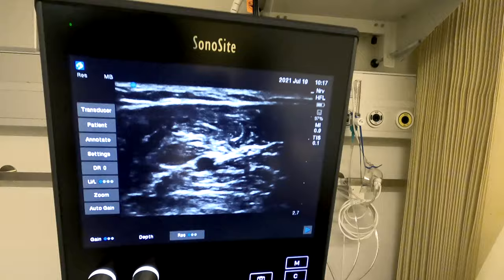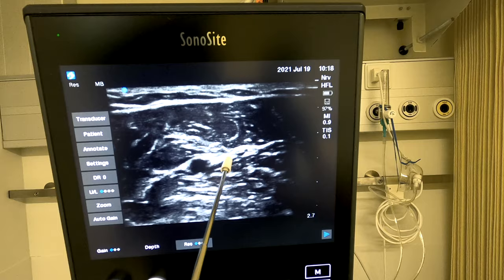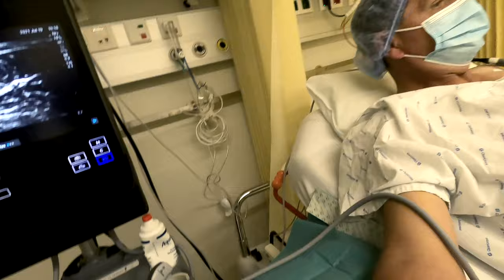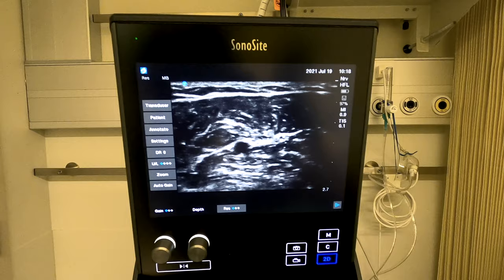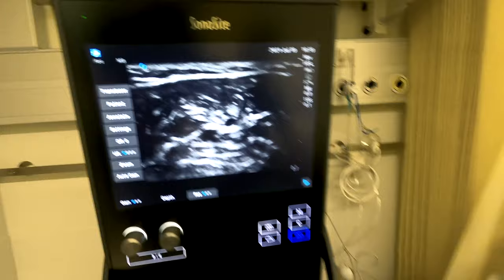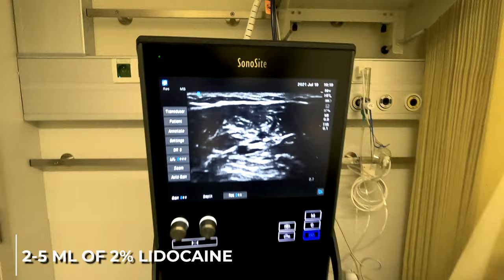Now we can see a nice image of the ulnar artery and the ulnar nerve right next to it. We have plenty of space in between the two to pass the needle and inject local anesthetic again between the tissue sheets of the superficial and deep flexors. We use an out-of-plane technique here — it's fairly superficial and allows a great degree of control. Advance deeper, pull back a tiny bit, slack off the pressure, and now we can clearly see how the ulnar nerve has been encircled by the local anesthetic.